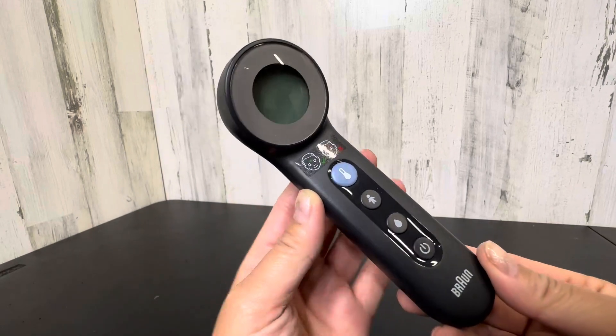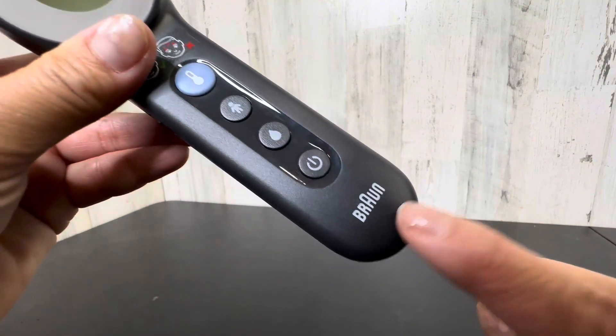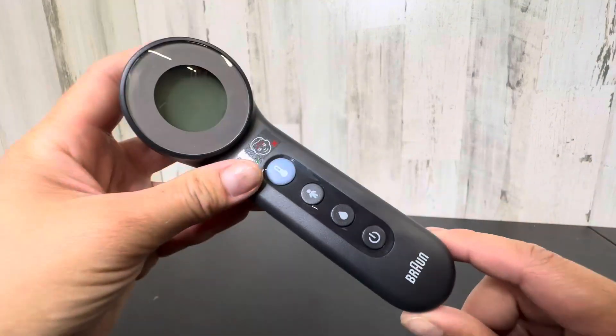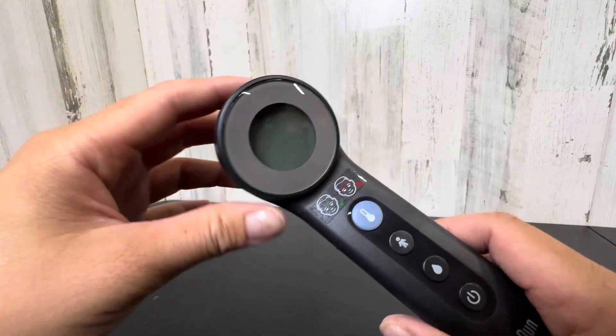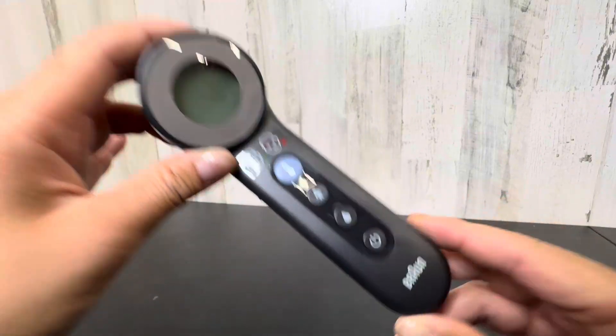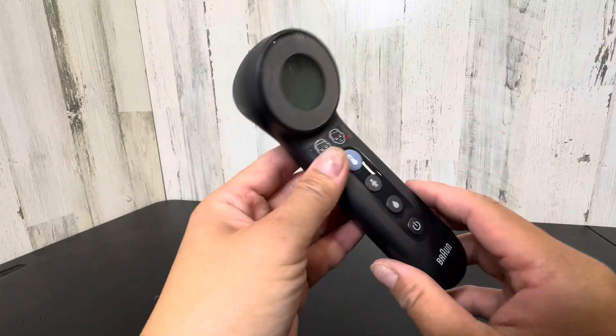Hi everybody, I want to quickly show you this Braun thermometer that I really like. Braun is a great company. I have quite a few appliances from them and they really are standing behind their products. I wanted to buy this thermometer because of that specific reason.